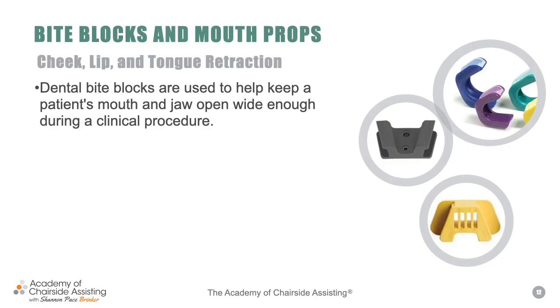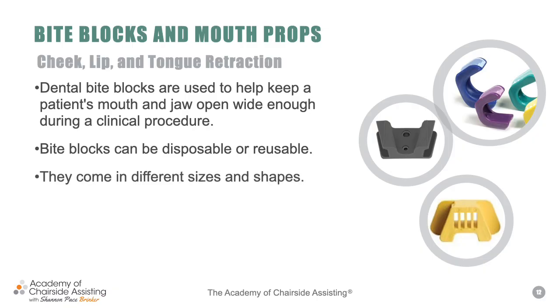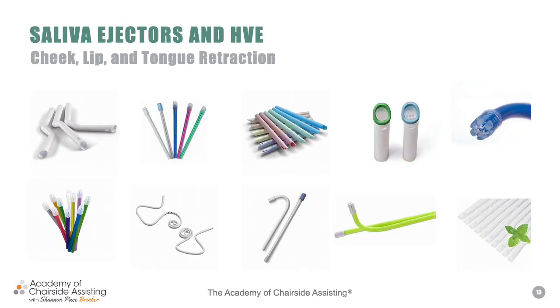But the downside of this is I also have a bad disc in my joint. So you got to be really careful with these long-term bite blocks. But for shorter time frames, I think sometimes this is good, and a lot of dentists like to utilize these. And so again, they come in different sizes. It also helps, I think, sometimes for a young adult or a young patient not to bite down on the handpiece, which also is great. So we want to make sure that you also, again, are familiarized with those in case that is something that you're going to be utilizing in your practice.